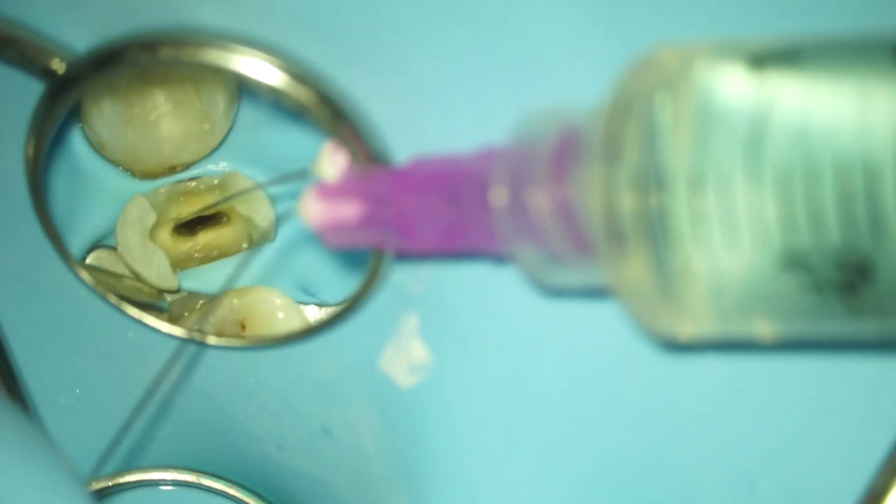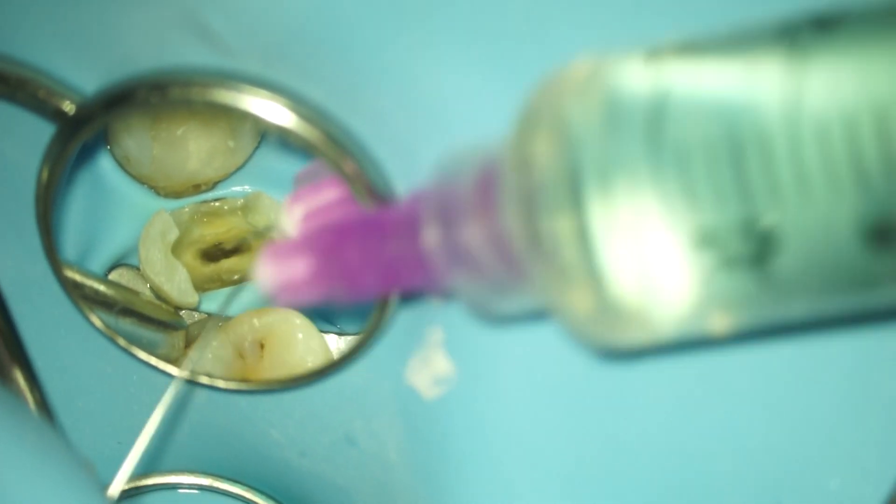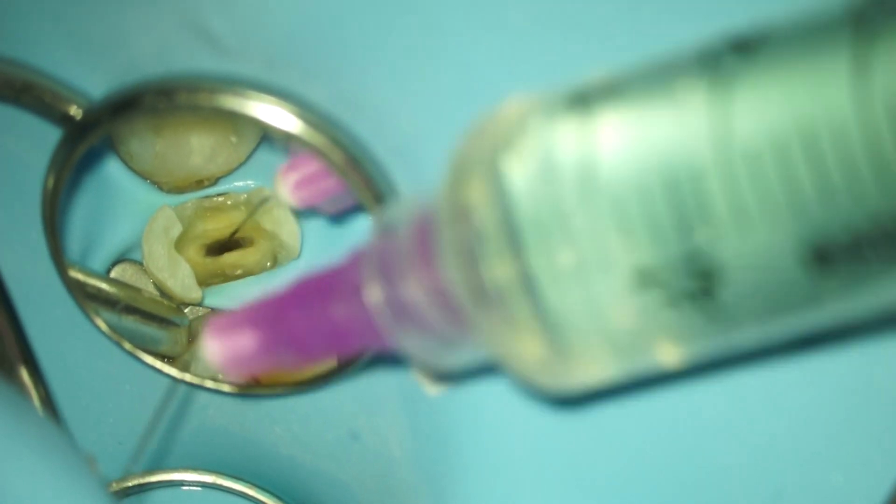Then of course some initial rinsing. As you can already tell, I need a pre-endo buildup, but this is just some initial rinsing that I do first.